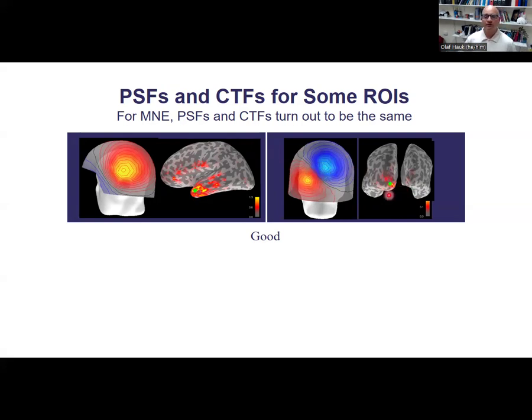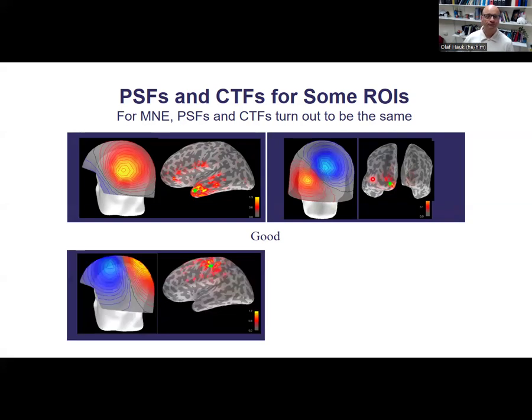And you can see here the point spread function. The green circle almost covers it. So it's quite focal. It's probably still a bit blurred compared to the true source, which we don't know, but it will be a few square millimeters, I guess. There are some speckles around here, but it's confined to at least the left hemisphere and quite focal around the green dot, the green circle.